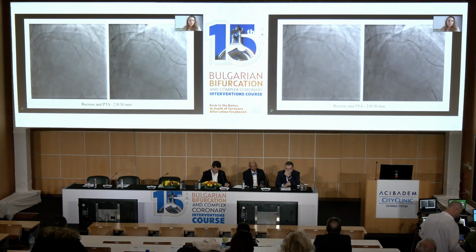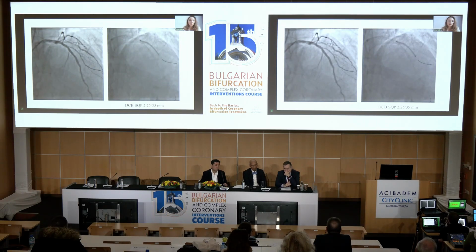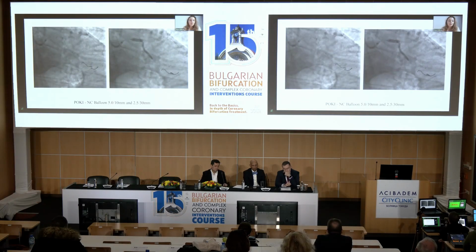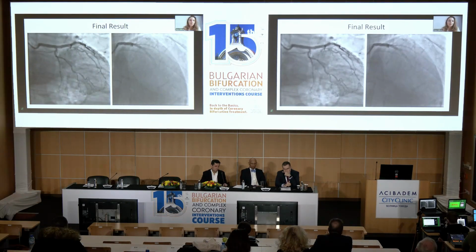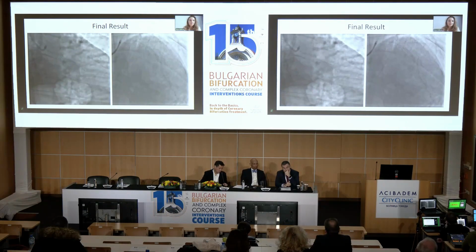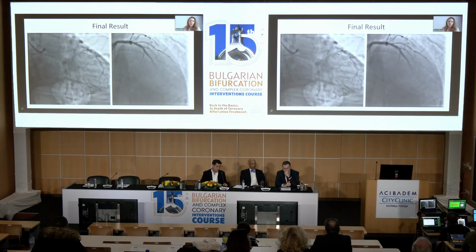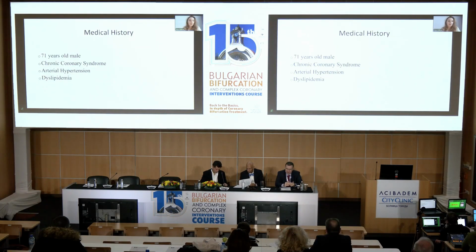POT, then drug-coated balloon in the first diagonal, and pocket technique, proximal optimization combined with kissing inflation in the left main bifurcation, with this final result.